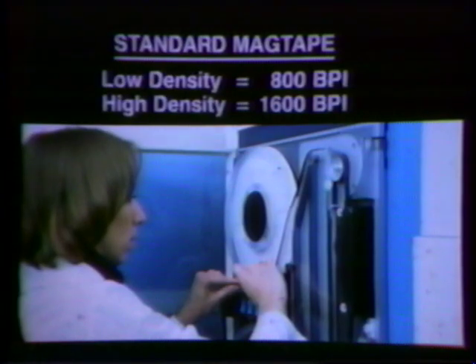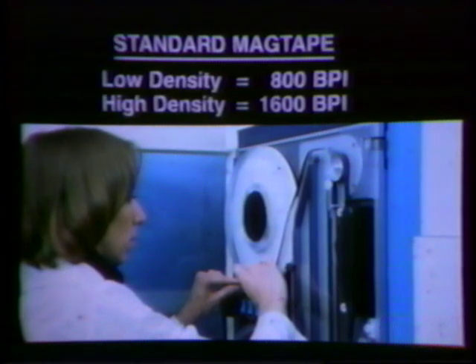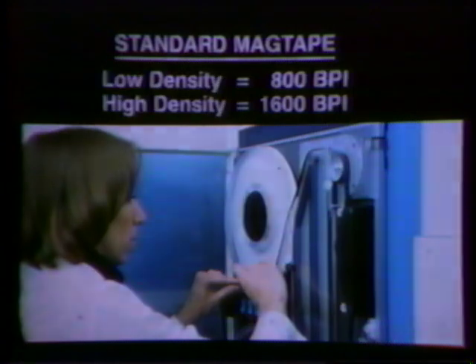Tape is generally referred to by how many bytes it can store per inch of tape, since different size reels can hold different lengths of tape. The standard tapes are either low density, meaning 800 bytes per inch, or high density, meaning 1,600 bytes per inch.